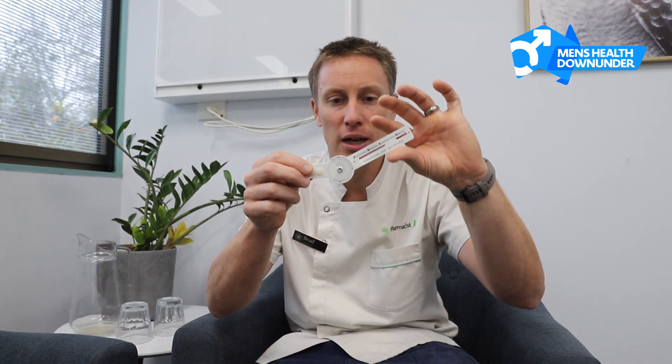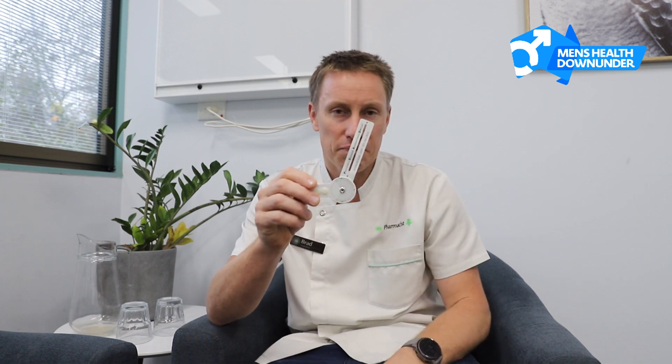And that makes it a lot easier for them to understand what's going on. Better than that, as time goes on and you're managing the condition with traction, medication, a pump, or focus shockwave therapy, you can continue to measure the improvement. It's one thing to look at a picture and say it's getting a bit better, but it's another to say it's gone from 60 degrees back to 30 or 20 degrees.